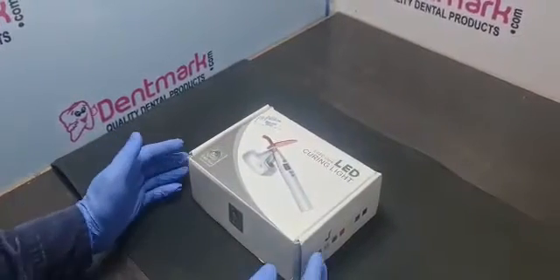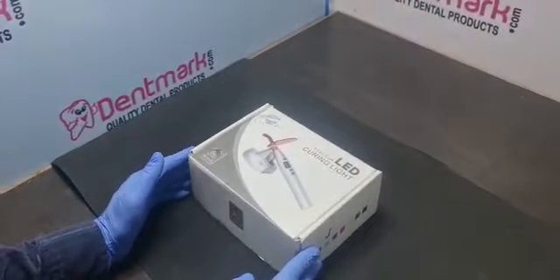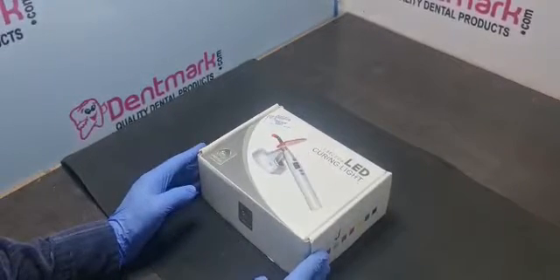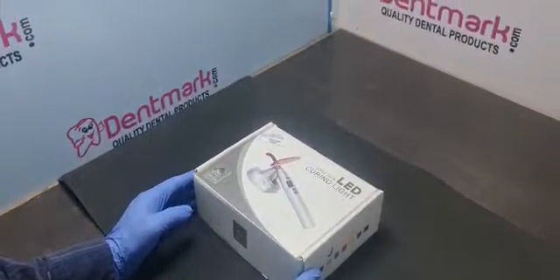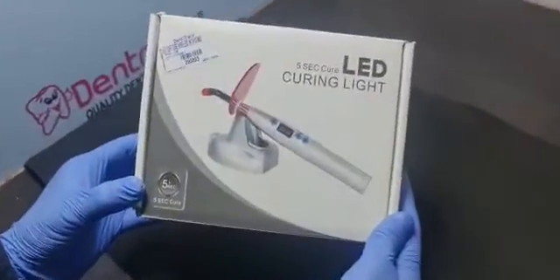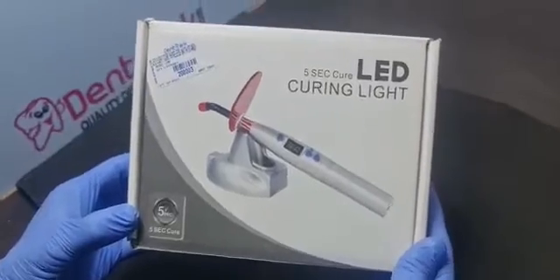Hello friends, Dentmark is going to show you some models of light cures — how to unpack, usage, and specifications. This model is the LC 08.